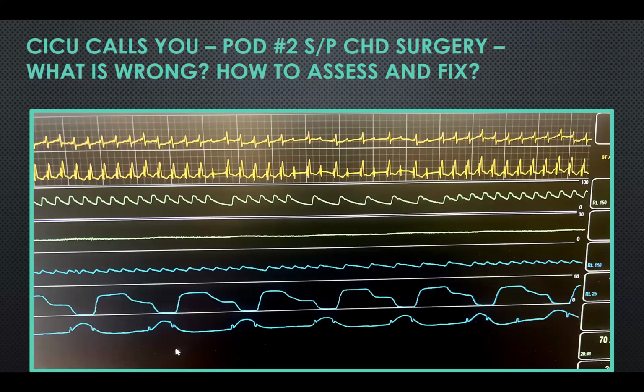Are the pacing spikes turned off here, or is that a pacing spike kind of in the second lead? I would remind that this monitor is on the so-called pacing modality, so it is augmenting the spike. And these are simultaneous leads, the top and the bottom. I don't know why it only is showing it on one of the two channels and not both. Is that lead the atrial, like the amplify? It could be. I don't think so, though, because the patient was being paced. So actually, no, this is not an amplified tracing. It's a good question.